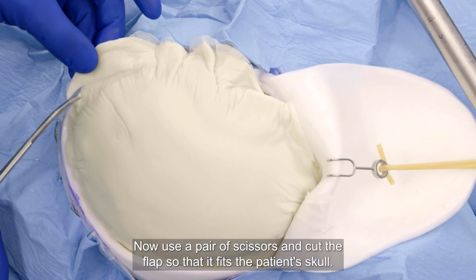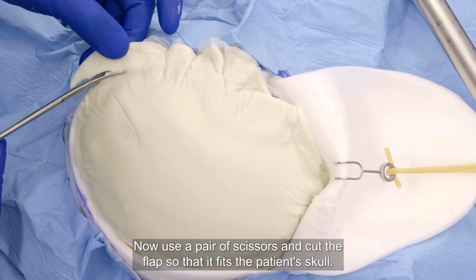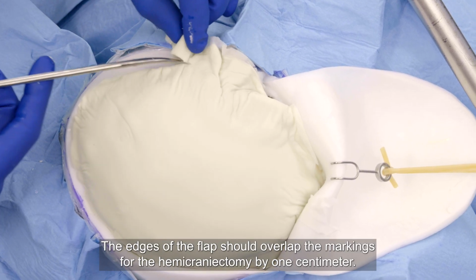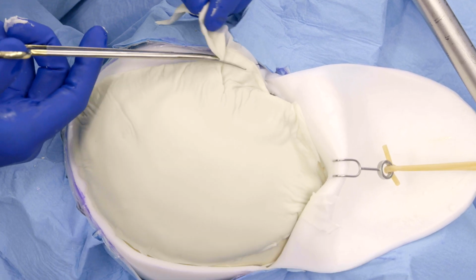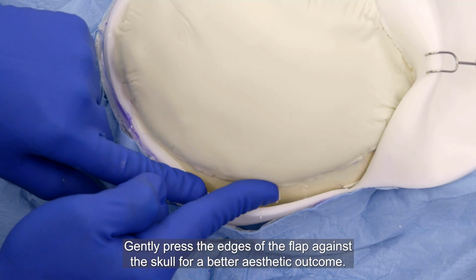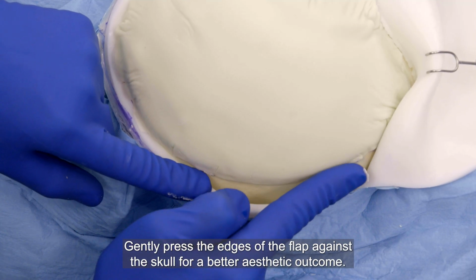Now use a pair of scissors and cut the flap so that it fits the patient's skull. The edges of the flap should overlap the markings for the hemicraniectomy by 1 centimeter. Gently press the edges of the flap against the skull for a better aesthetic outcome.